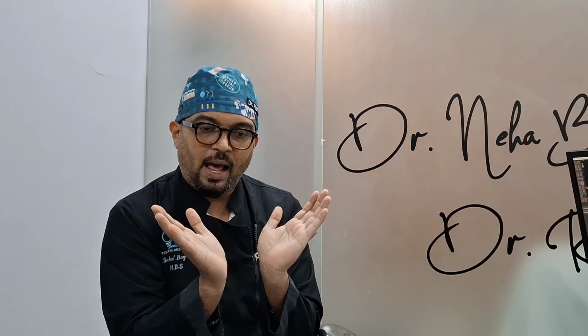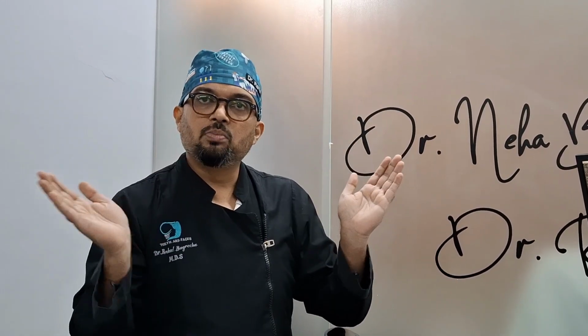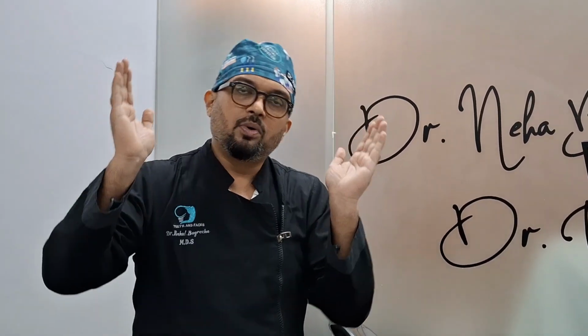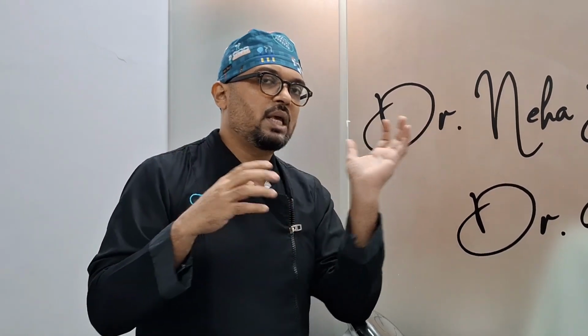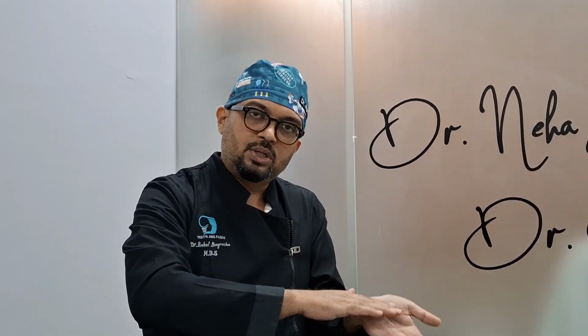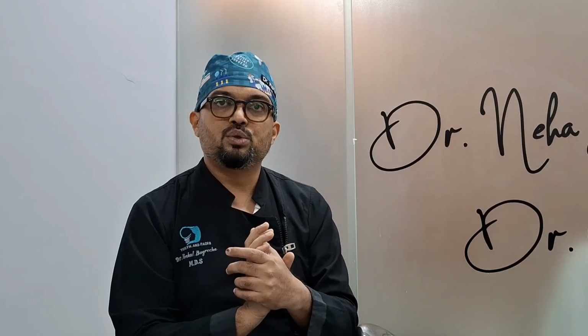crown. So what will happen is my crown will have a lot of cantilevers on both sides. So when the patient eats, this crown is going to put forces on either side of the implant, and these forces are like shaking a pole to take it out. These are called cantilever and lateral forces. Now in this case, it is not only lateral, there are mesial and distal, front and back forces also. A normal single implant has cheek side and tongue side forces. Here the front and back forces would have been added.